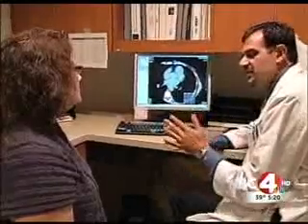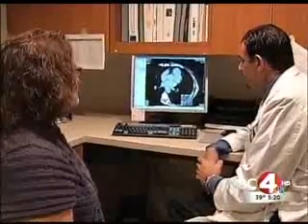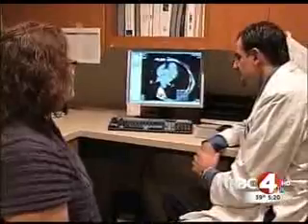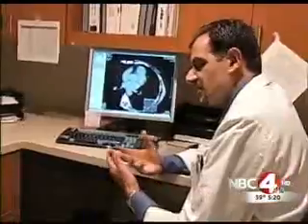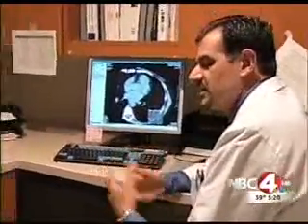The good news we're seeing here is that basically there's really no evidence of any significant plaques anywhere in these arteries. But the scan did find that one small spot in her right coronary. It's very, very unlikely that plaque would ever cause any kind of problem over, say, the next 20 years. Still, beyond family history, Dr. Grewal wants Cindy to work on reducing other risk factors so this little speck doesn't become something a whole lot bigger. Work on the smoking, which clearly over time, can lead to heart problems.